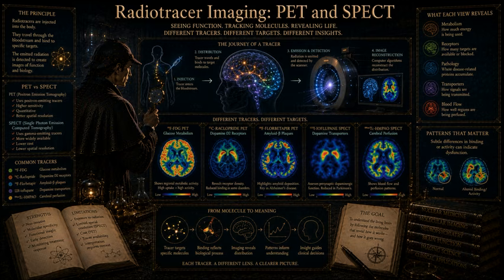Yes, we were. Using a radiotracer specifically designed to bind to SERT, called 11C-DASB, researchers have scanned cohorts of current and former heavy MDMA users. In this context, measuring SERT availability isn't just about the transporter. It acts as a structural proxy for measuring the physical integrity and density of the serotonin nerve terminals themselves. And what did the scans reveal? They consistently observed heavily reduced SERT availability, sometimes showing a 20 to 30% massive reduction, particularly in the prefrontal cortex of recently abstinent heavy MDMA users compared to matched healthy controls.